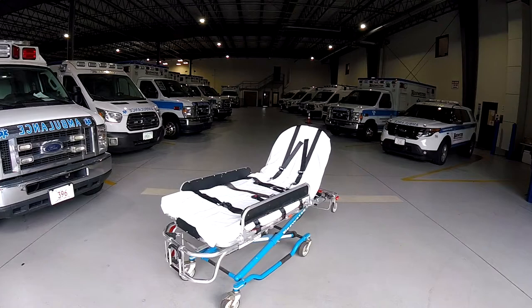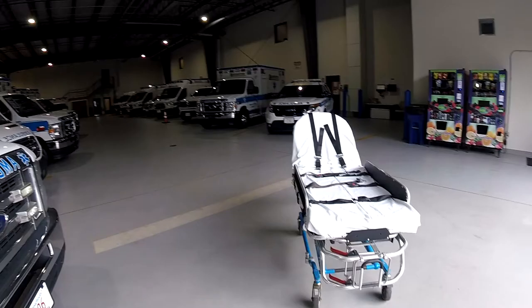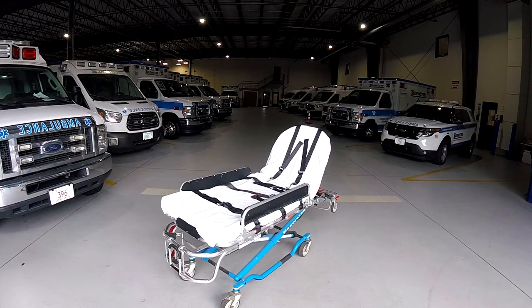Please take note of the bariatric stretcher that we have at Brewster Ambulance. When utilizing this stretcher, please ensure that you have an appropriate amount of team members in order to facilitate a smooth, safe lift. When transporting a patient on this stretcher, it is imperative that the stretcher is set at a proper transporting height. Avoid rough ground or terrain that would cause a stretcher tip.